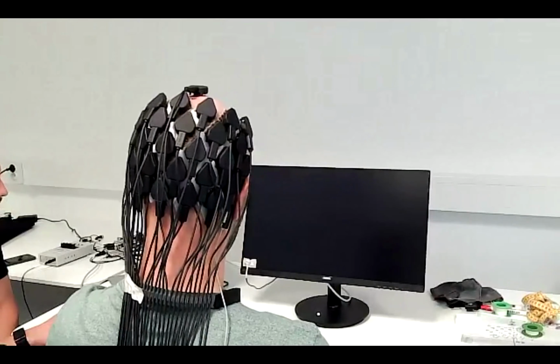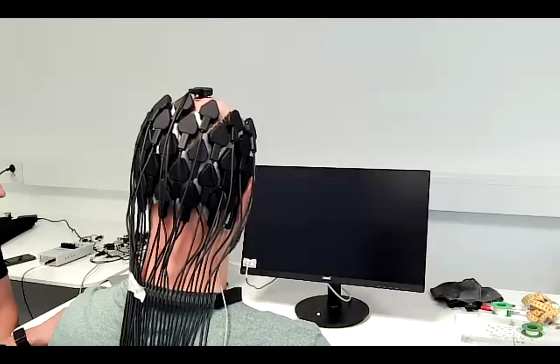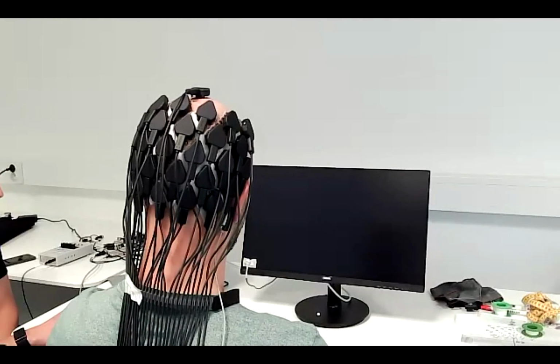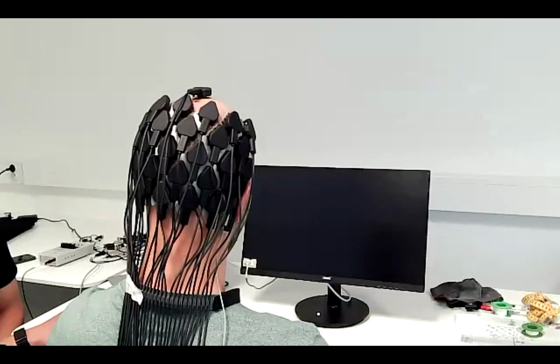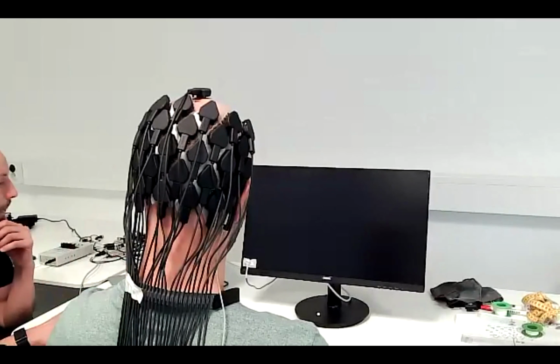And we use this then to plot the EPs, just to show you here the online functioning of the system. I will show it to you first with the camera, and then whenever Christoph can add me with my computer, the experiment computer, I can also do a screen share of the model.